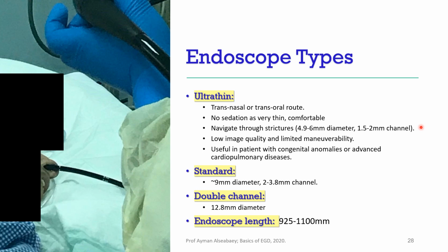But its drawback is that it is very thick. So it is more bothering to the patient, and it will annoy him, especially if you don't use sedation. But it is also useful in another point. What is the other point?